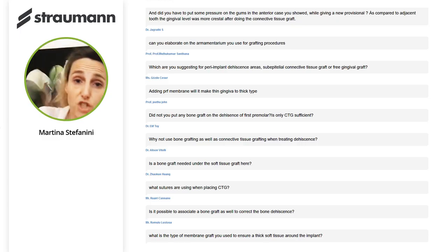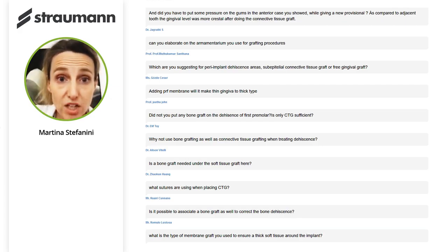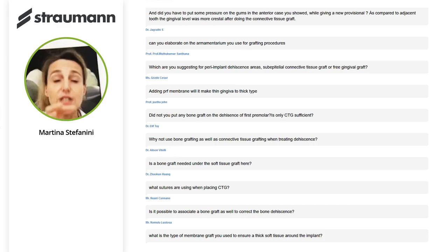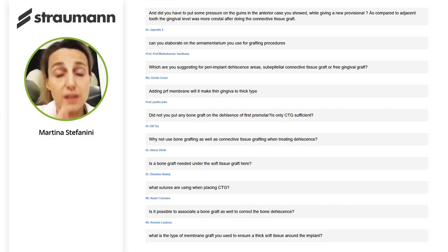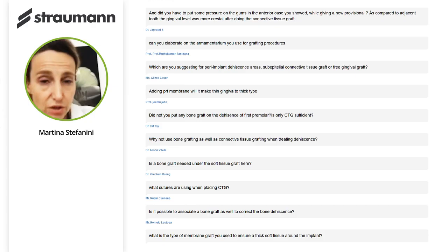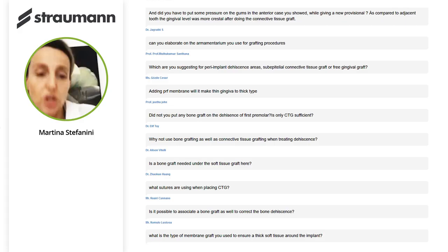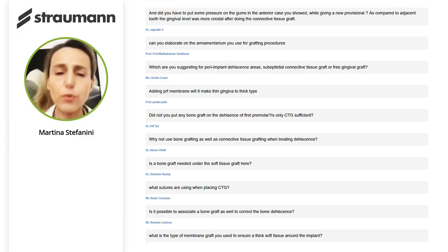In this way, the surgical papilla above the desepithelialized anatomical papilla will have anastomosis, an exchange of vascular supply, and this will ensure the survival and the stability of the coronally advanced flap. The other type of desepithelialization is the desepithelialization of the free gingival graft to obtain a connective tissue graft. I know there are other questions regarding the harvesting technique.